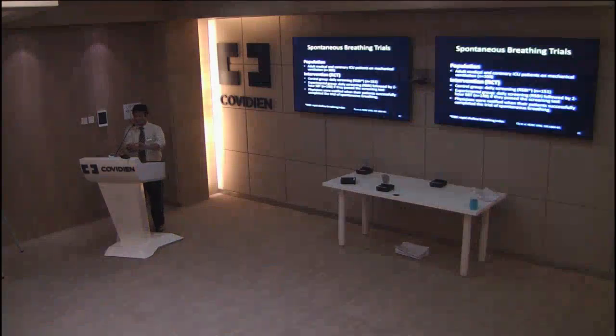The next thing which is evidence-based is spontaneous breathing trials. Spontaneous breathing trial again goes hand in hand with daily interruption of sedation, so that's why it needs to be combined together. If you're going to give a spontaneous breathing trial to assess the patient's readiness for extubation or separation from a ventilator, you need that patient to be separated out from the sedation before you do that.